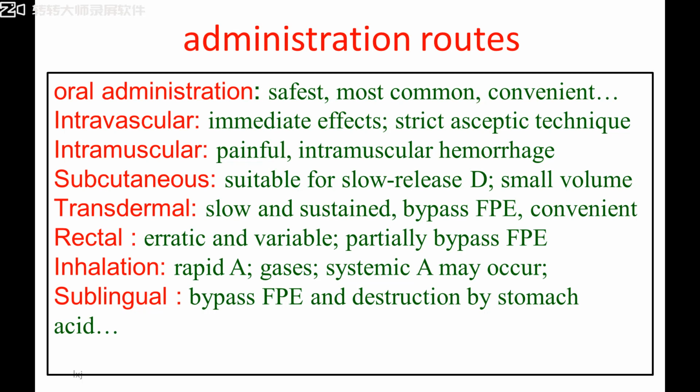Intravascular administration. This route has no process of absorption. It can induce immediate effects. That's why intravascular injection is very common in some emergency. And of course, it always requires a strict aseptic technique. You need a nurse to help you with intravenous injection.